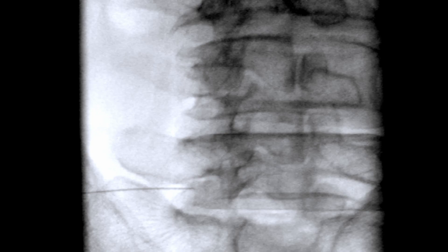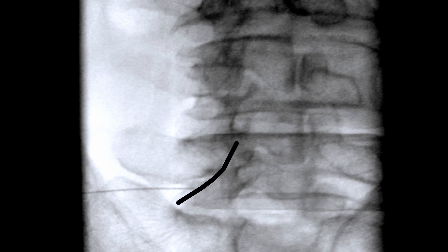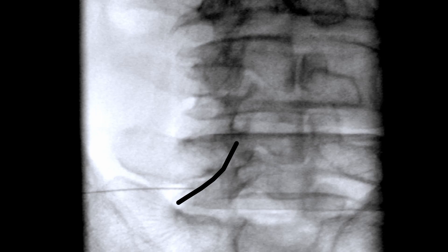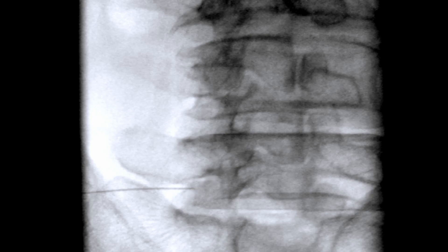I introduced a refined approach to guarantee a comprehensive contrast distribution within the circumneural sheath and epidural space. This method necessitates the initial positioning of the needle against the bone, followed by a slight downward tilt before steering it towards the intended path, facilitating fluid movement along the bone.